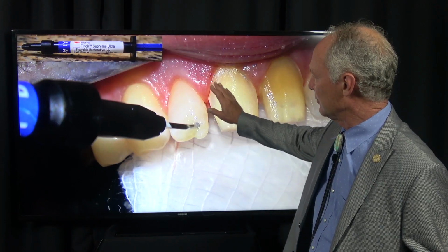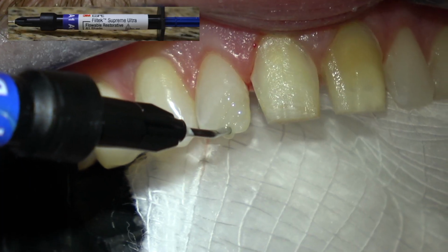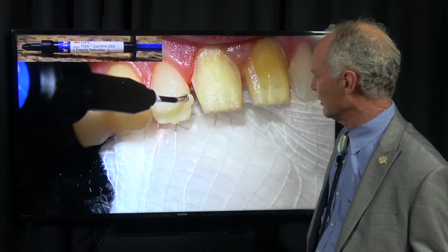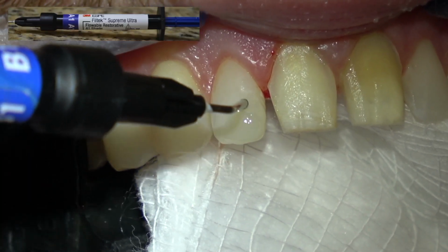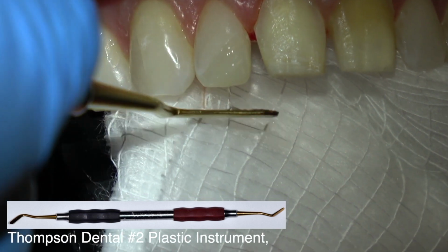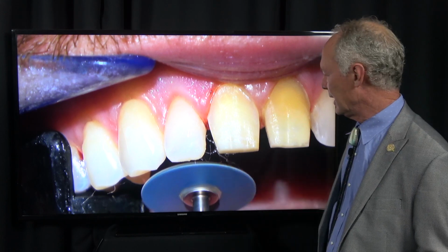Now I've decided to use Filtek Supreme Flowable because it adapts so well to the tooth preparation. Keep the tip of the syringe in the material. Don't come in and out or you'll incorporate air bubbles. And even if you do it perfectly, you may incorporate some air bubbles, which I did in this composite, and I'll show you what to do if that happens. And I'm just going to contour it a little bit with this plastic instrument, and then I'm going to cure it. And I generally cure direct composite 40 seconds. You probably don't have to cure it that long, but you can't over cure.